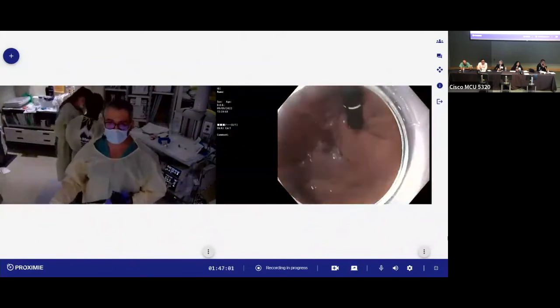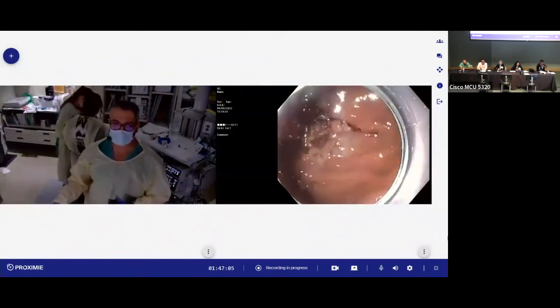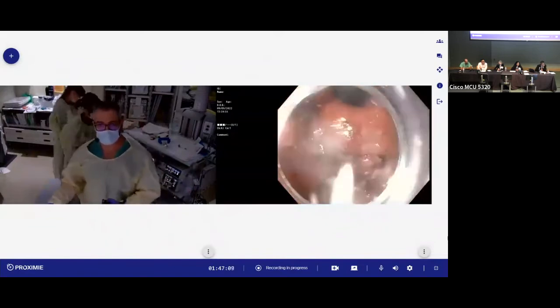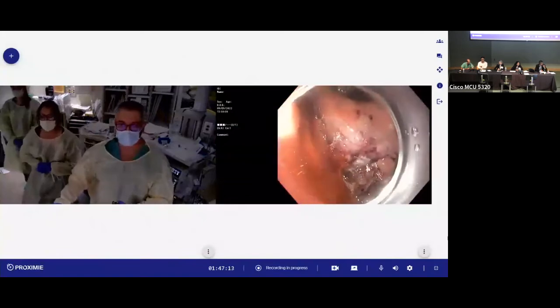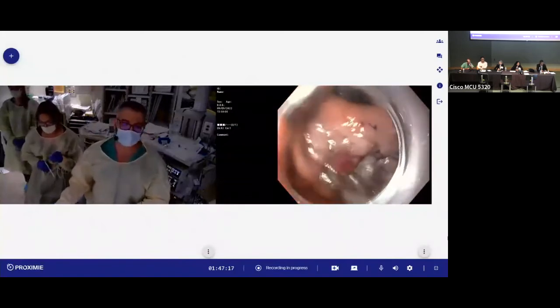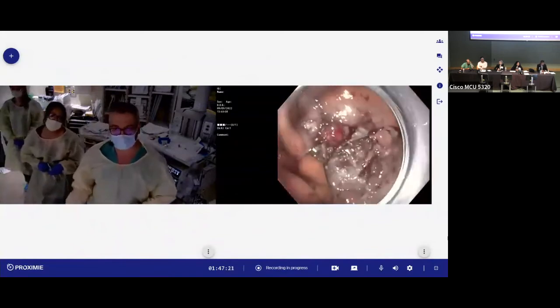We have another one closer to it here, and they grow large to look like this one. The only problem with this one is that it came in a tough location that's very hardly seen. But I also learned if you leave any residue, they grow back and come back in 2 years with another polyp. So that's why I'm trying to remove all the base.